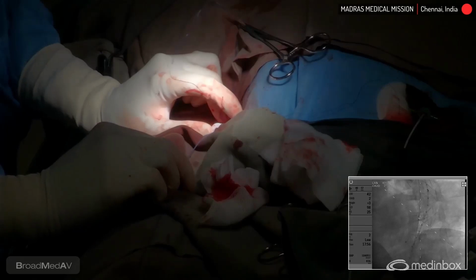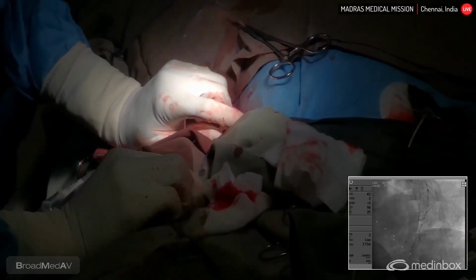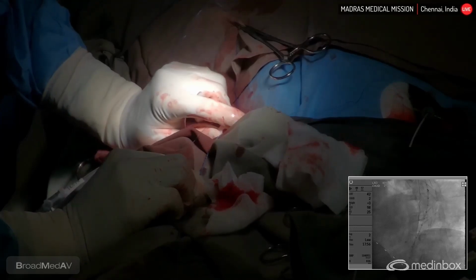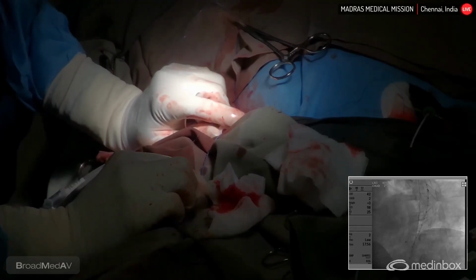So first, I would like to remove this stiff wire out of this device. Ashish, can you take a JR and bring this stiff wire out and we can exchange it to a 035 regular wire.